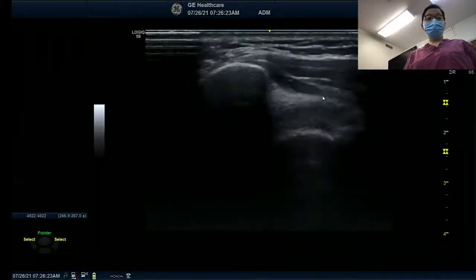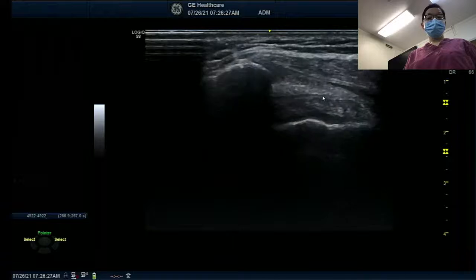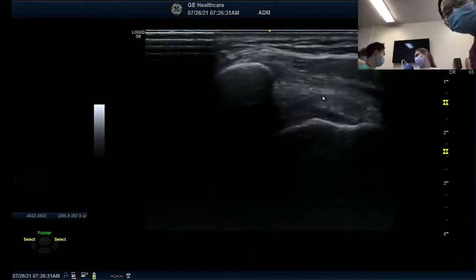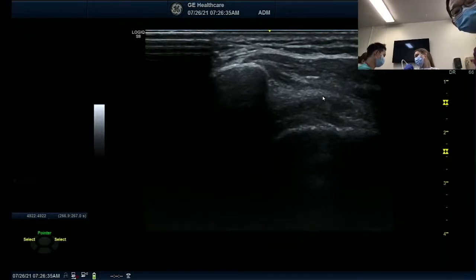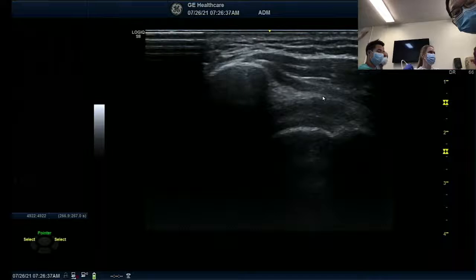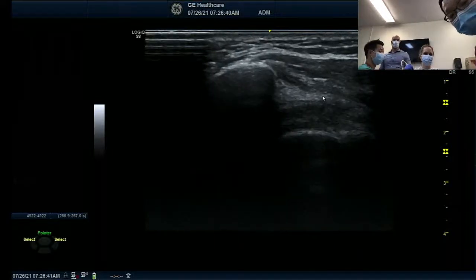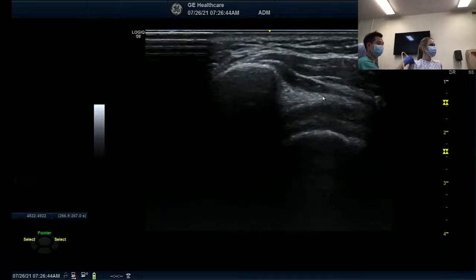Right there, I see the space. You can play with it a little bit so you see it. The Wi-Fi was not great, so we're going to restart streaming.